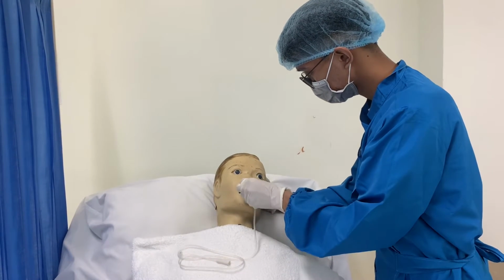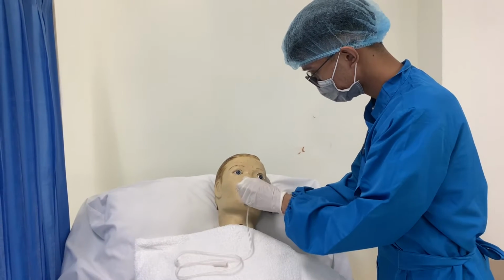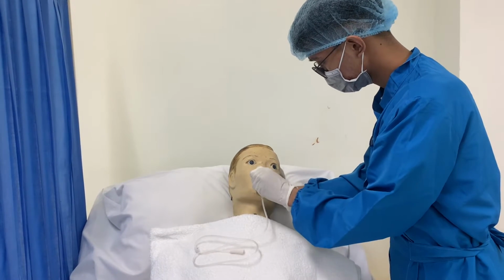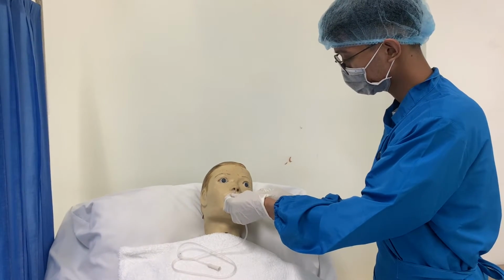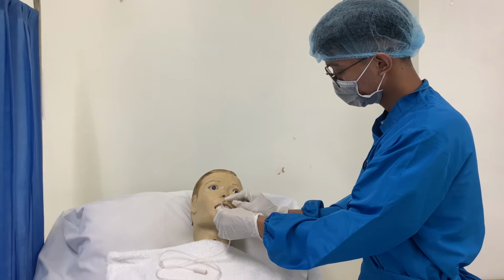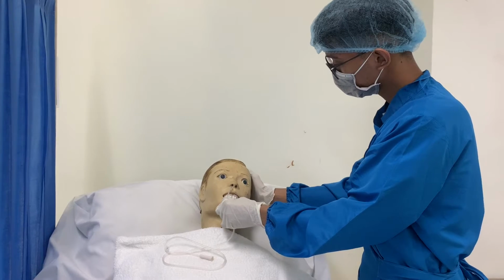If the tube is curled, straighten the tube and attempt to advance again. Keep advancing the tube until the pen marking is reached. Do not use force. Rotate the tube if it meets resistance. If the patient shows signs of distress such as gasping, coughing, cyanosis, and inability to speak or hum, discontinue the procedure and remove the tube.